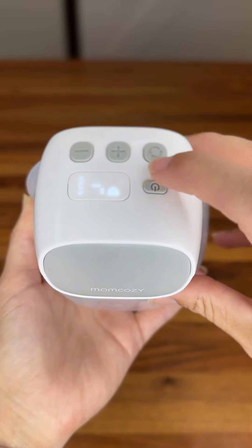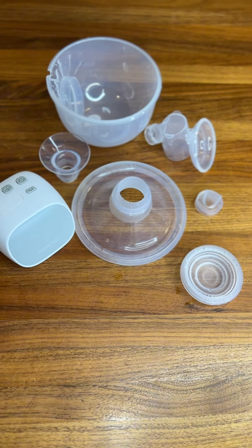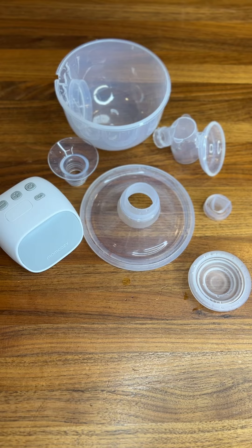With the Mom Cozy S9 Pro, there are multiple levels and it can do a suction or a massage mode. My other favorite part of this breast pump is that it's easy to clean and there's only five pieces that you have to clean per breast pump.